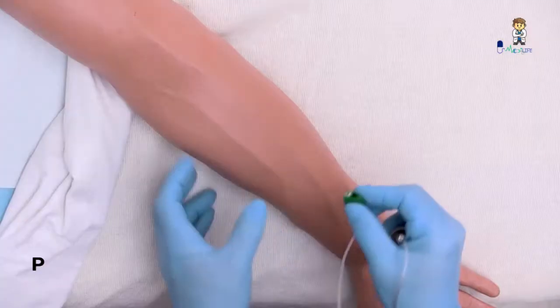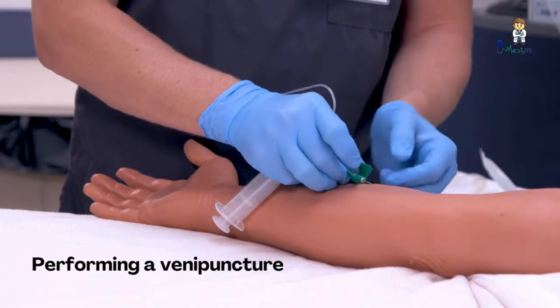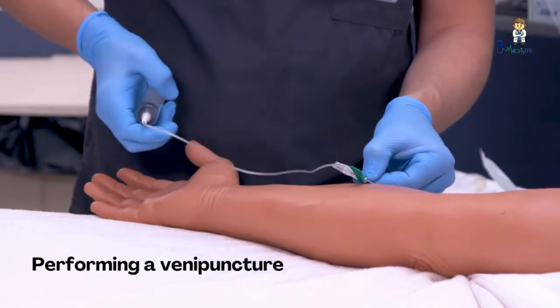If palpation is necessary, put on a sterile glove. If you're also drawing blood for other laboratory tests, draw blood for culture before drawing the sample for other tests.